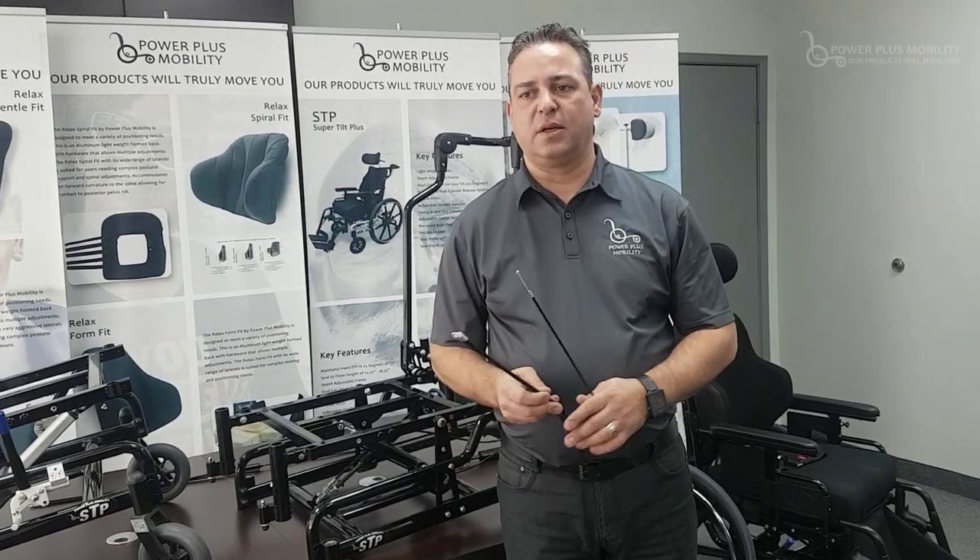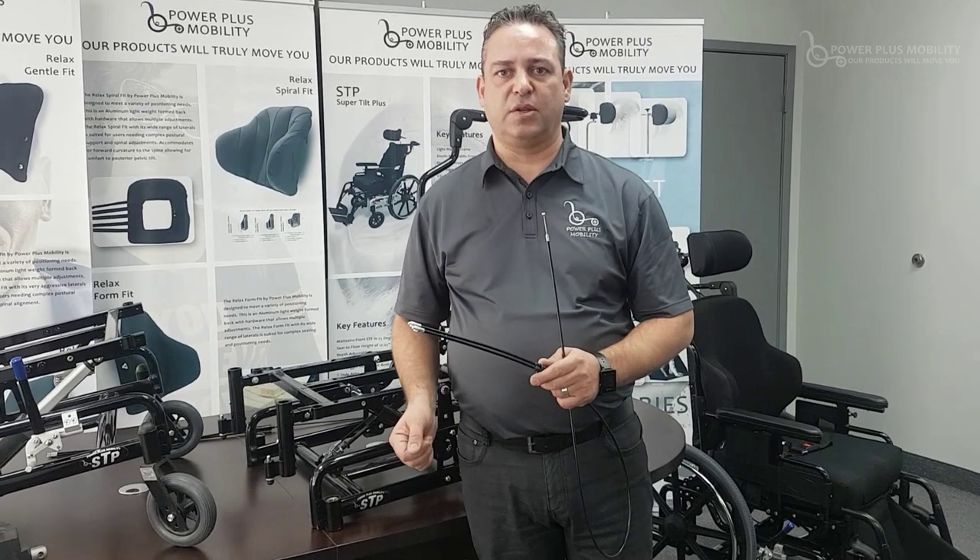Depending on weight capacities, we do change the cylinders. For somebody who is perhaps above 250 pounds, we go up to a maximum of 400 pounds, using a cylinder rated at 400 pounds and 500 pounds. Those are the standard cylinders that we use on our tilt chairs.